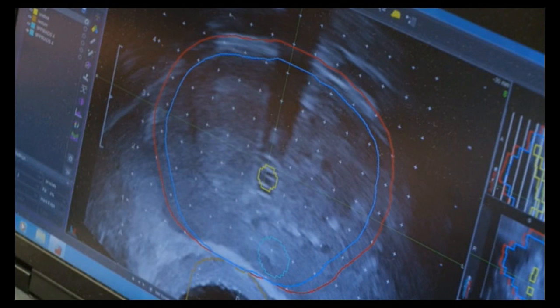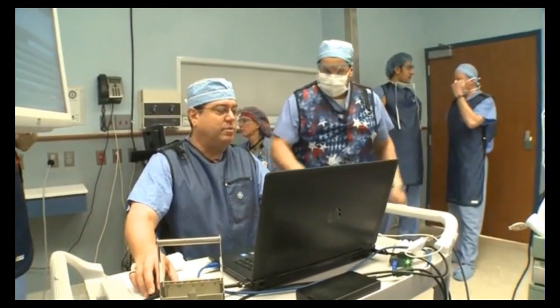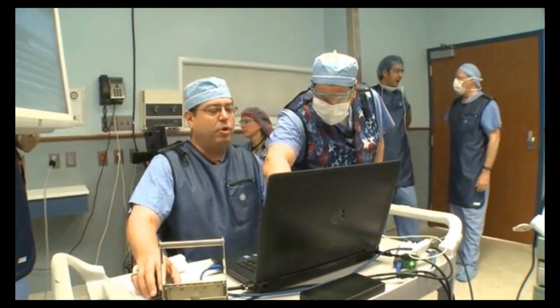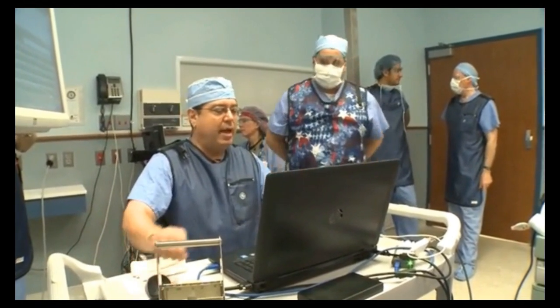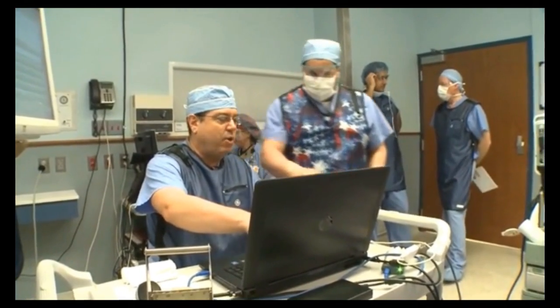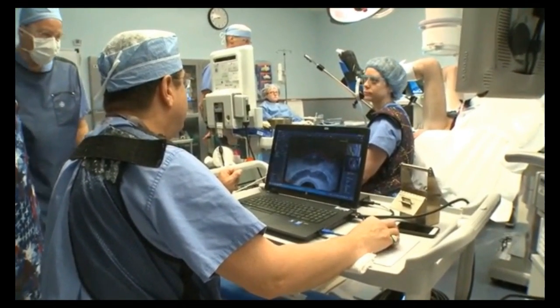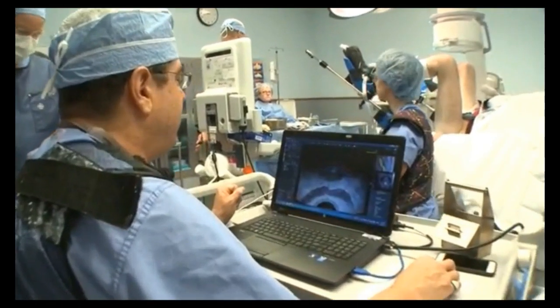I haven't seen a brachytherapy case since I stopped — what, 2011? Even if you go anywhere else, you ain't going to see this. But it looks normal on ultrasound. It's only on the MR that you could see that target. So basically you're going to paint more — put more dose in that area. And since it's close to the rectum, I give it 150% of dose. That's right in the middle where I wanted the SpaceOAR product to lift away. This is a fairly new planning system — it's MIM, what they call their Symphony planning system.